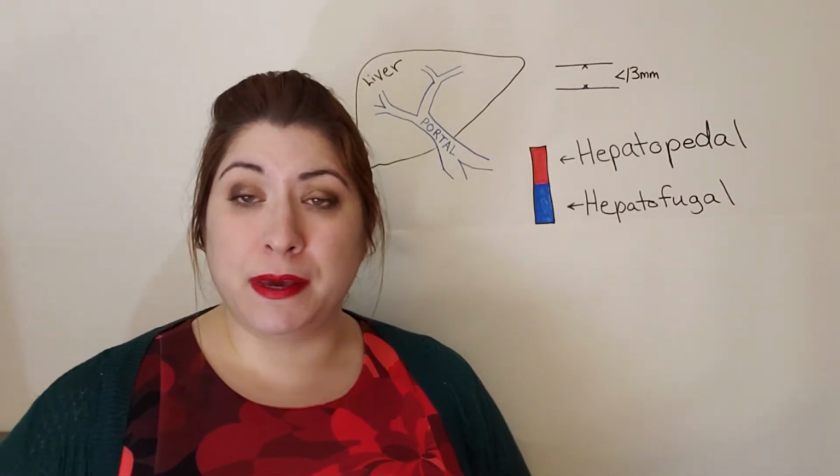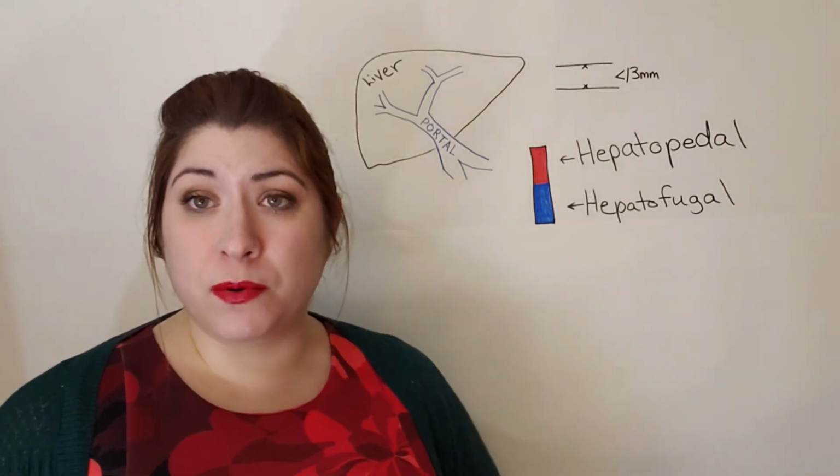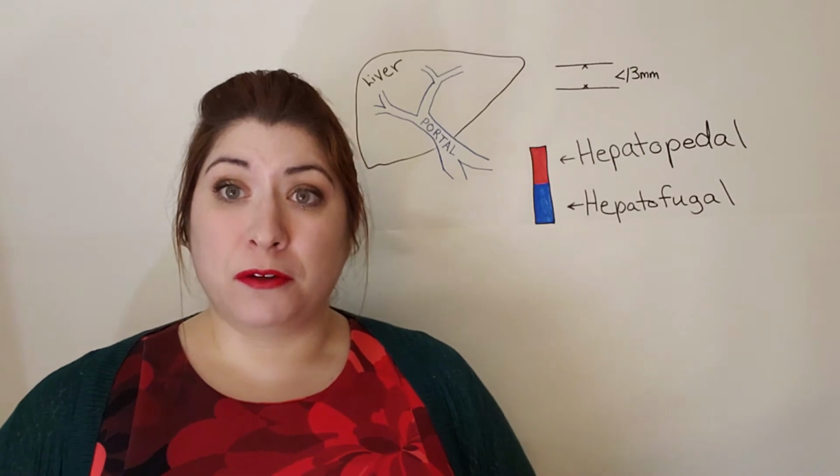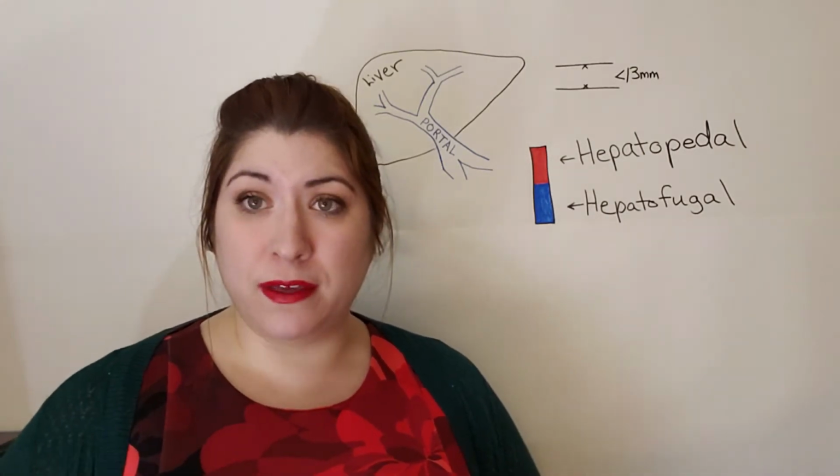Another indication could be if they have portal vein thrombosis. They can actually have thrombus within the portal vein lumen. With ultrasound, we can actually see that most times. We'll see a blood clot within that lumen.